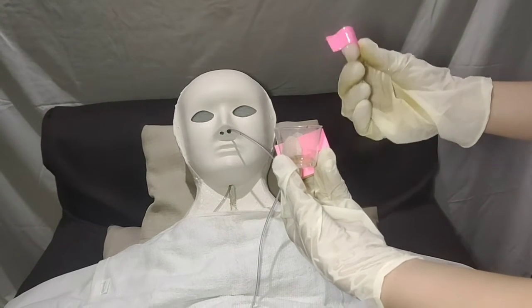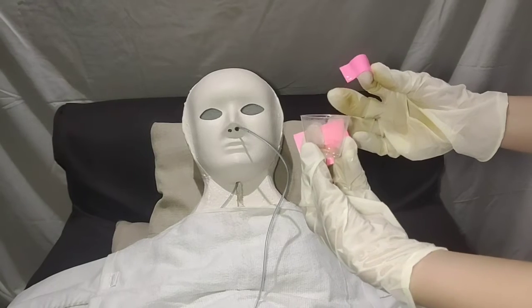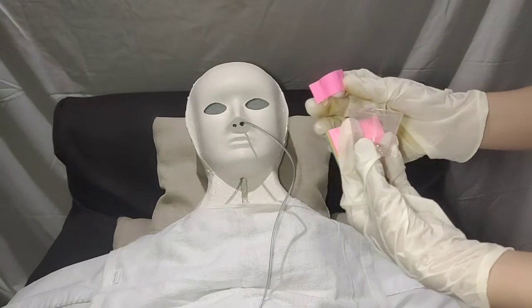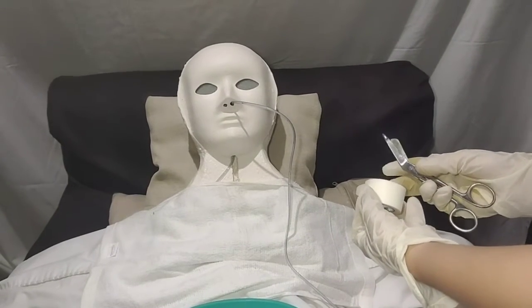Aspirated contents is color tan. pH level is 4.0, which means the tube is placed in the stomach. Secure tube with commercially prepared device or tape to patient's nose.